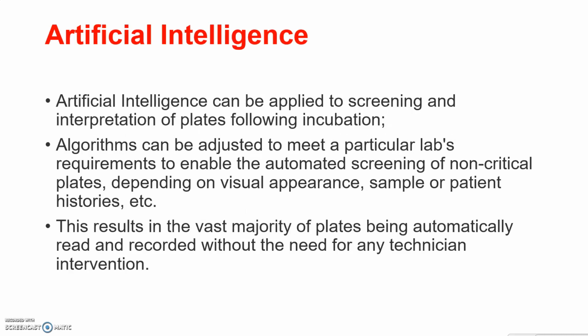Artificial intelligence can be applied to screening and interpretation of plates following incubation. Algorithms can be adjusted to meet a particular lab's requirements to enable the automated screening of non-critical plates depending on visual appearance, sample or patient histories. This results in the vast majority of plates being automatically read and recorded without the need for any technician intervention.